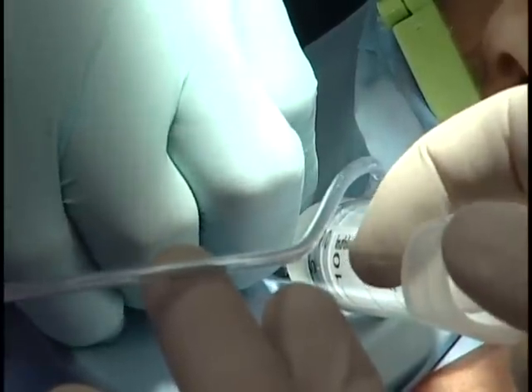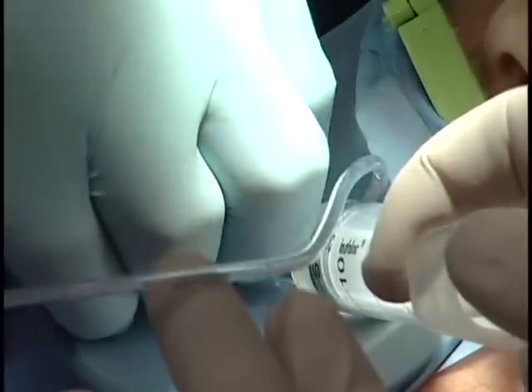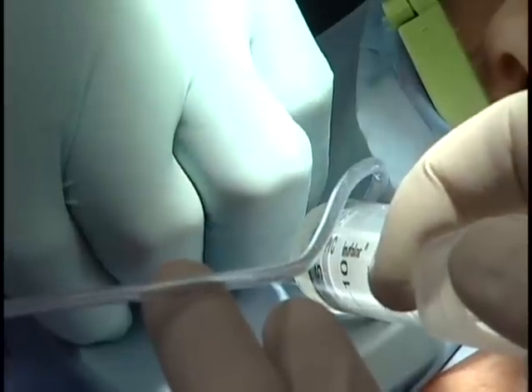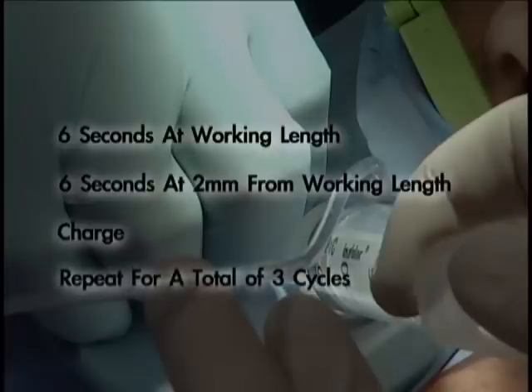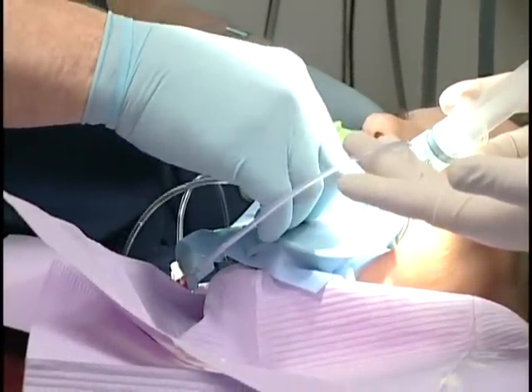Remember, Jennifer is irrigating up top while the micro cannula draws the irrigant safely all the way to the apical termination. The sequence for each canal is simple. 6 seconds at working length, then 6 seconds 2 millimeters back from working length. I'll do this a total of 3 times in each canal before leaving the canal charged and moving on to the next canal. Notice the debris and fluid being evacuated from the apical third.